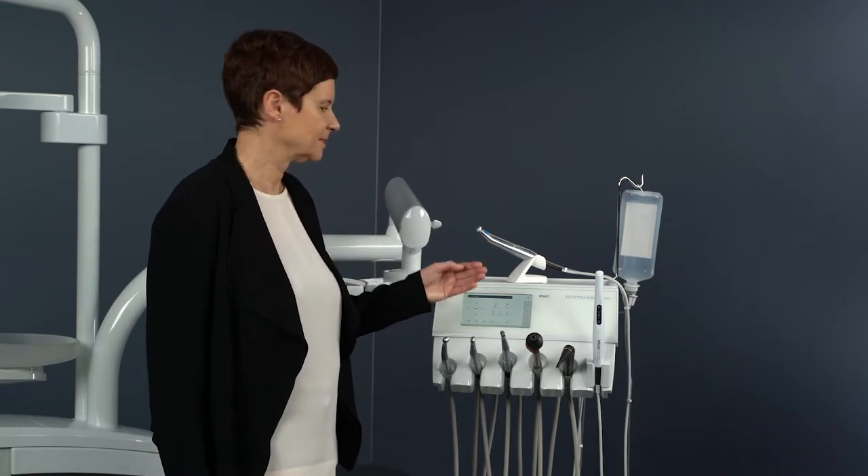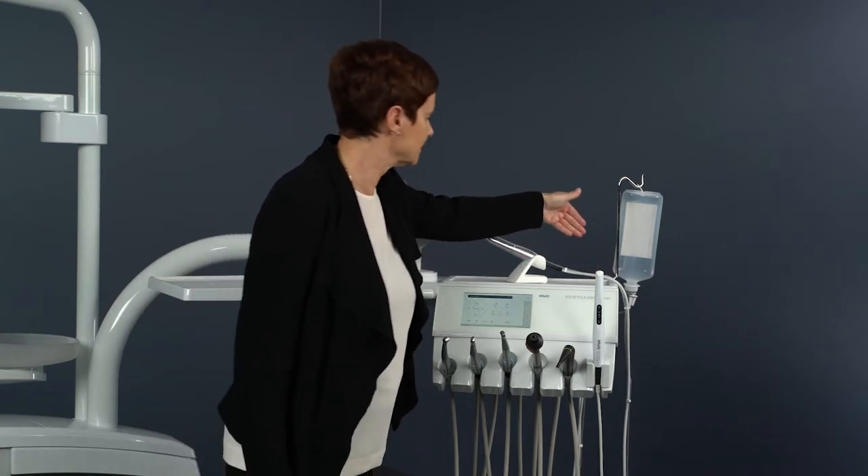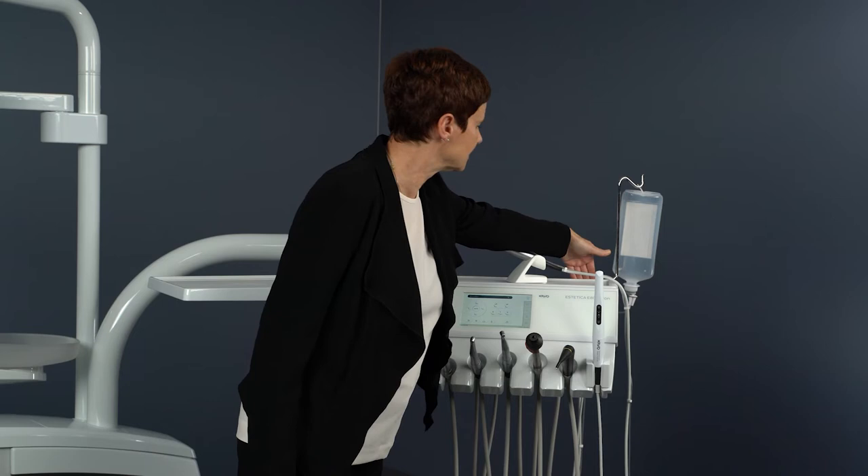The operation as well as the individual programming takes place on the Carvo treatment unit's intuitive touch display. The SL600 surgical motor set required to use the surgical function is supplied including the pump for physiological saline solution.